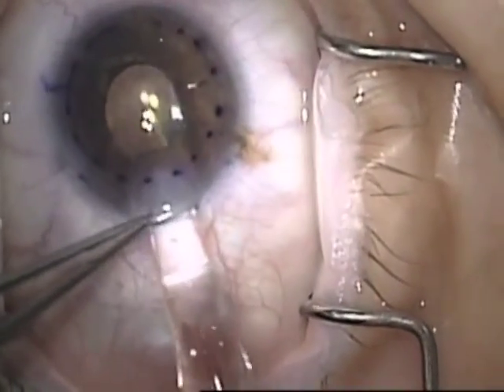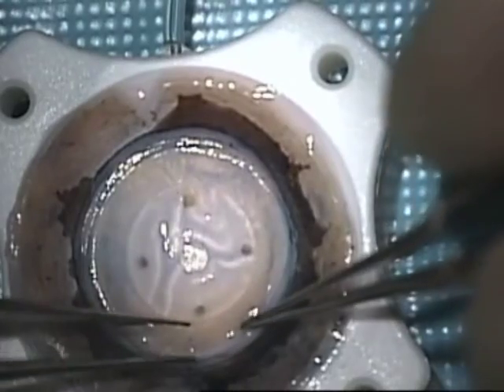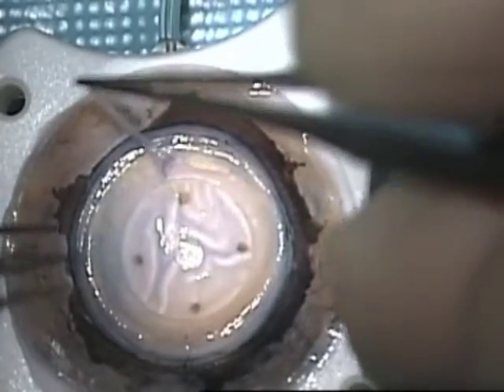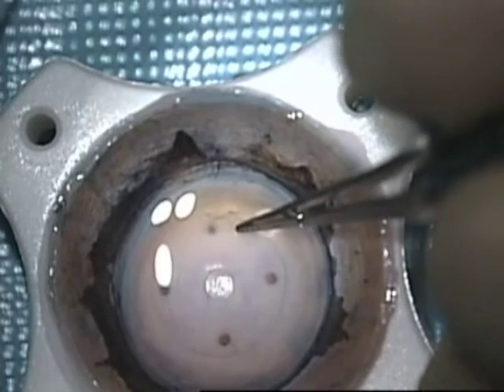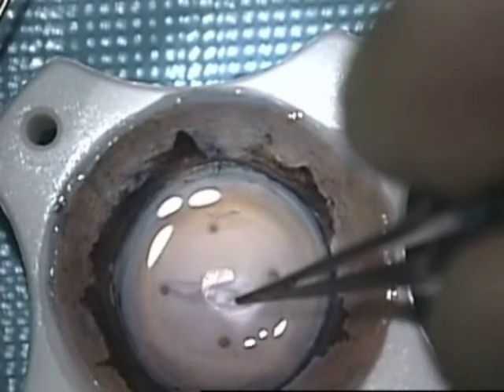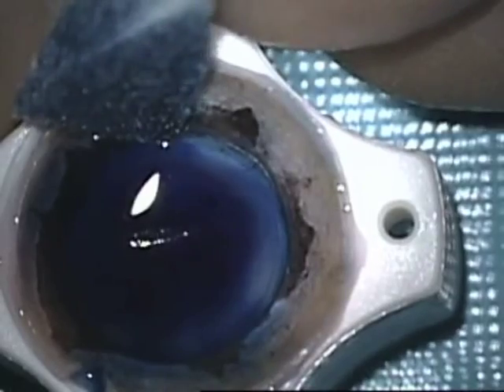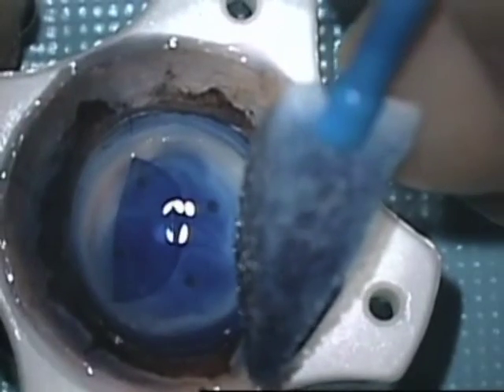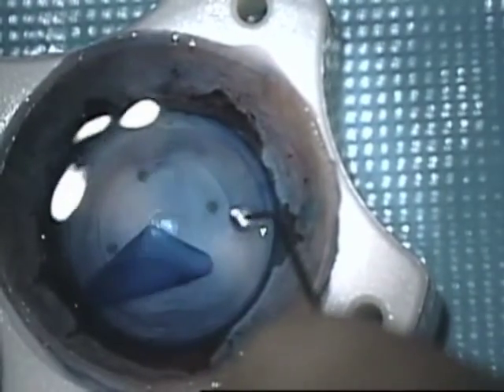I enlarge the wound to fit my Stryko glass DMEK injector, which fits through about a 3.2mm incision. TriPan Blue is used to highlight the edges of the pre-stripped tissue to make it easier to see where the stripping has been done. I'm placing a 7.5mm graft into this Fuchs Dystrophy patient, removing the peripheral Descemet's membrane, making sure I have a complete partial-thickness trepanation of the graft. I put some balanced salt solution down to lift the edge of the graft and carefully peel it away. Then applying TriPan Blue stain into that same well — I like to stain it right in the corneoscleral cap — and wash away the stain, then add back balanced salt solution so I have a freely floating graft.